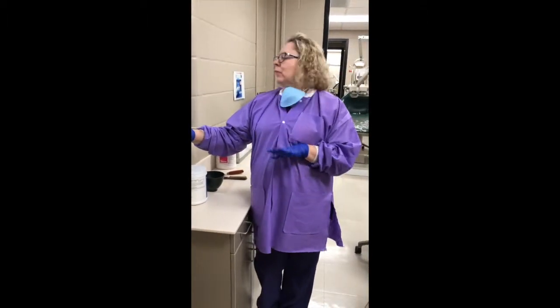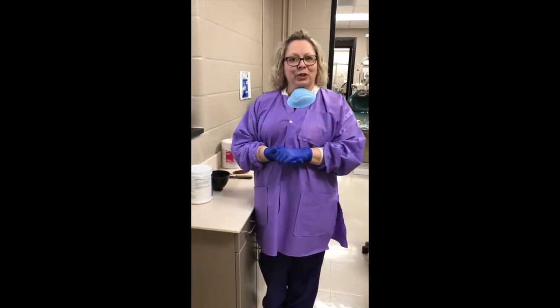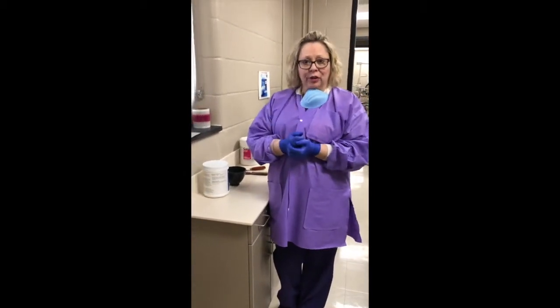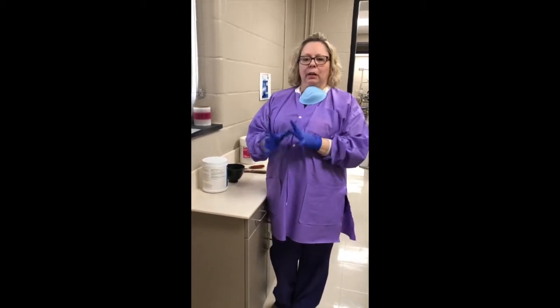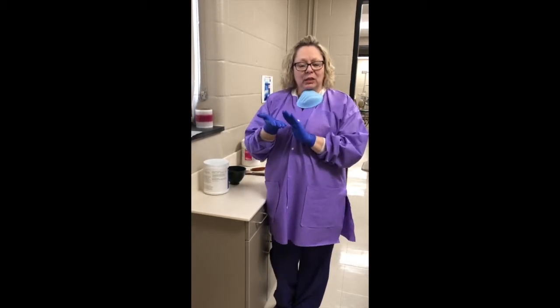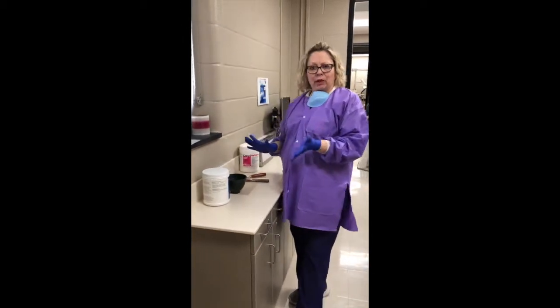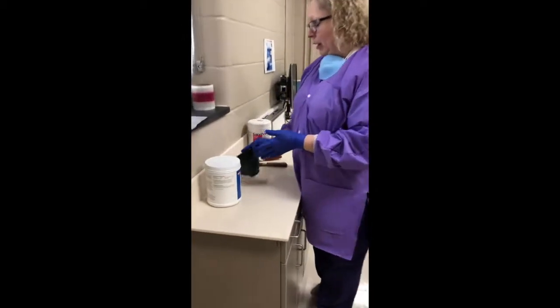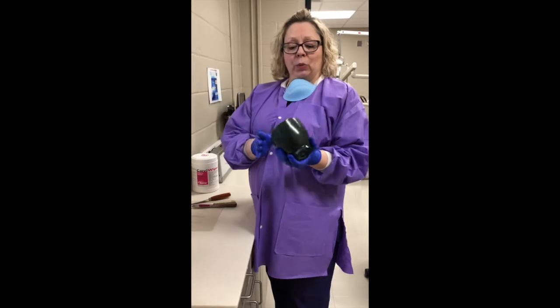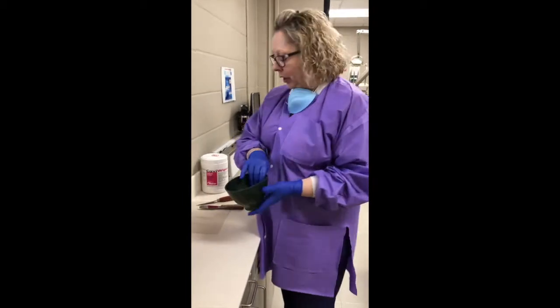The most important thing for you guys to get out of our lesson today in making an alginate is to make the impression with a well-mixed impression material. If you leave the material lumpy or bumpy, and you see it in the patient's mouth lumpy and bumpy, that affects the impression that you end up with at the end. So when we consider the armamentarium we use, of course we use an alginate impression material. We always use a flexible bowl versus a firm bowl, because as we work with our material, we tend to move and squeeze the bowl around to be able to mix it thoroughly.